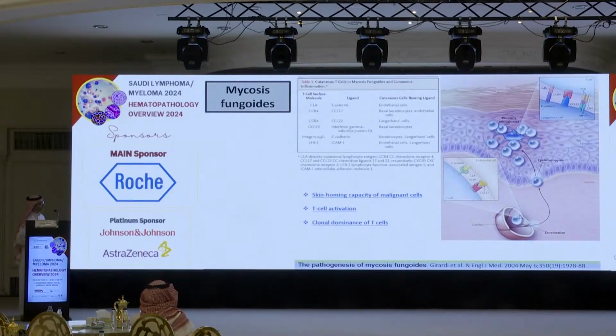They tag the dermo-epidermal junction, and they go around the Langerhans cells. That's why we see Pautrier microabscesses, because these atypical lymphocytes go around Langerhans cells and form these Pautrier microabscesses. And the other thing, another soft criterion or morphologic key that I use, when the mycosis fungoides is clonal, are clonal T cells.